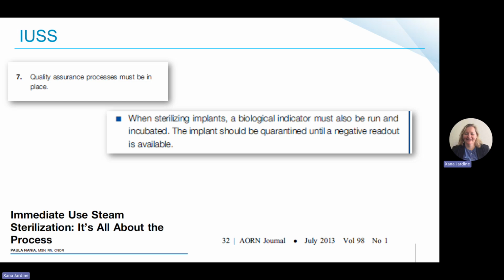Now, in this guideline, it goes on to say, if you've had a dire emergency, and I do mean a dire emergency, and you have to sterilize an item which is an implantable item, something that's going to stay in the patient, you really must notify infection control, and you must do a BI. They say in this guideline, you need to do a BI in the load, and you need to quarantine the device. Which, how do you do that? Because you can't keep it sterile until a negative result or readout is available. What are you going to do? Leave the patient on the table till you get a readout?